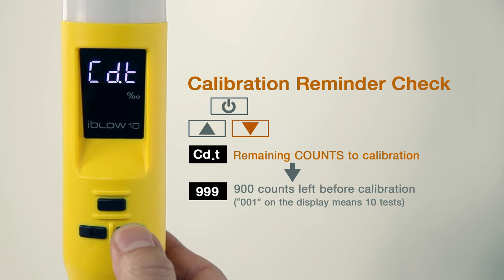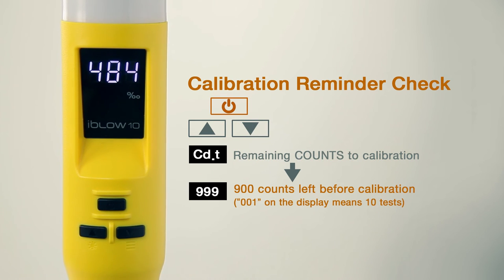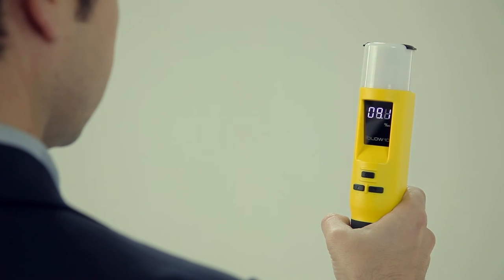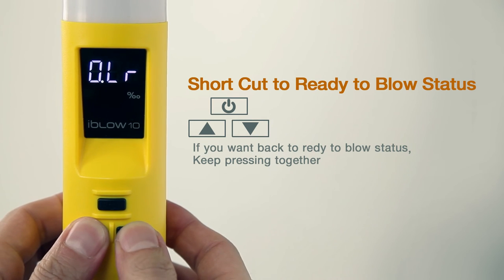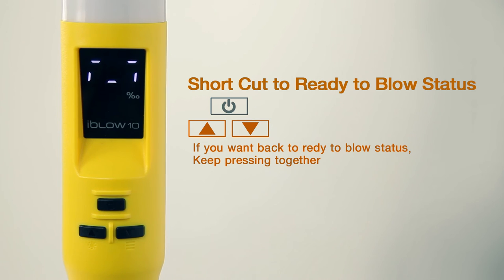CDT indicates the number of test times remaining until calibration from 0 to 9,990 tests. After exceeding the set test times, it will go into CAT, a grace period. After the set time of the grace period, the display will indicate CAL and no longer work. From the setting menu, you can return to GO mode by pressing and holding down the up and down buttons at the same time.